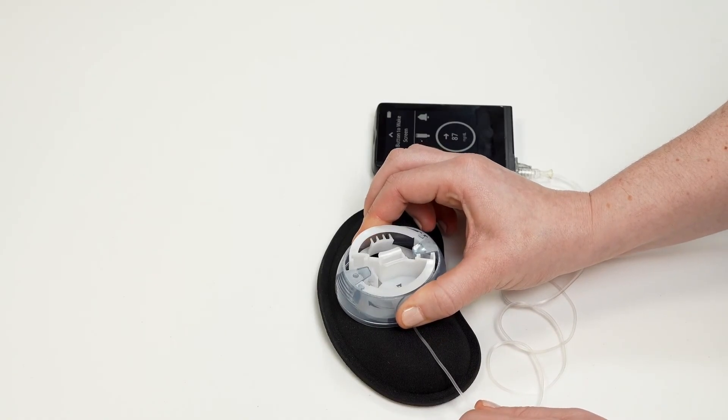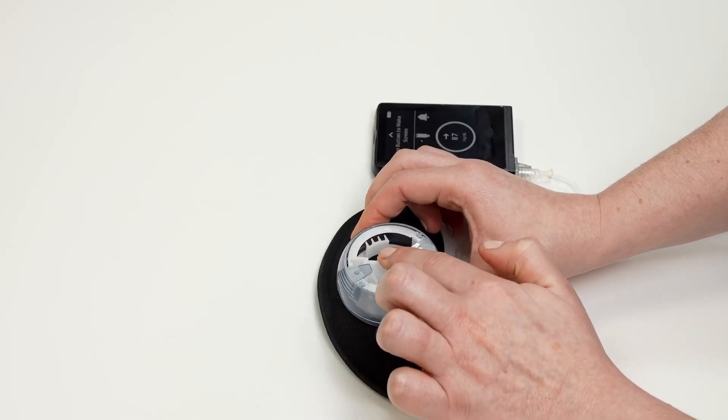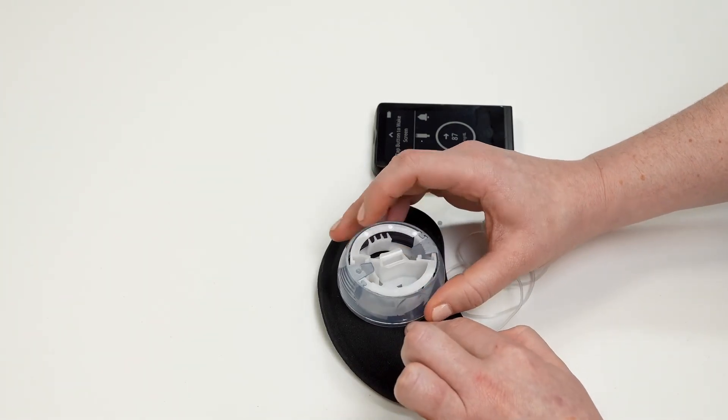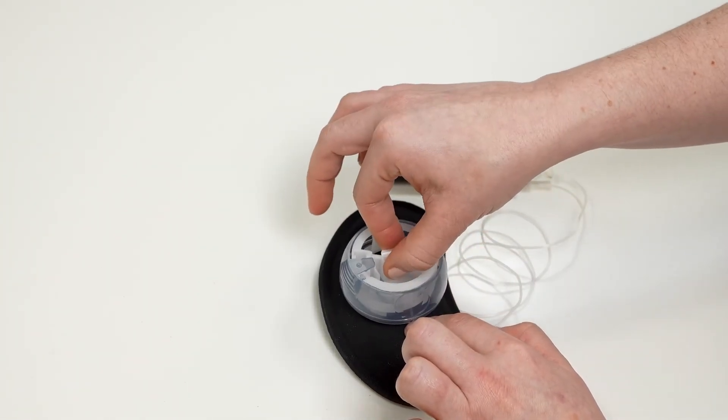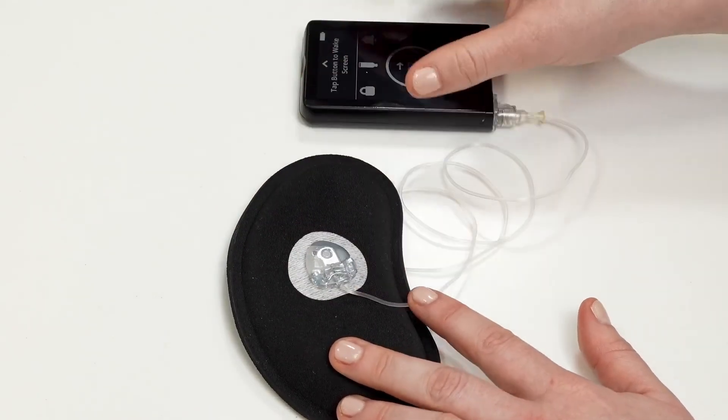Once it's inserted, gently push on the white handle of the inserter to help secure your infusion set. Grasp the handle of the inserter and pull straight backwards to remove the needle. Rub around the end of the adhesive to make sure it's secure.